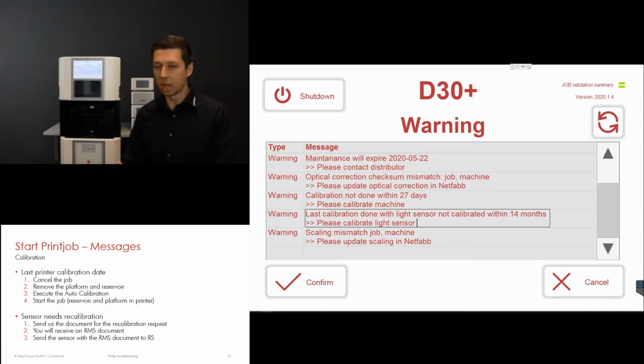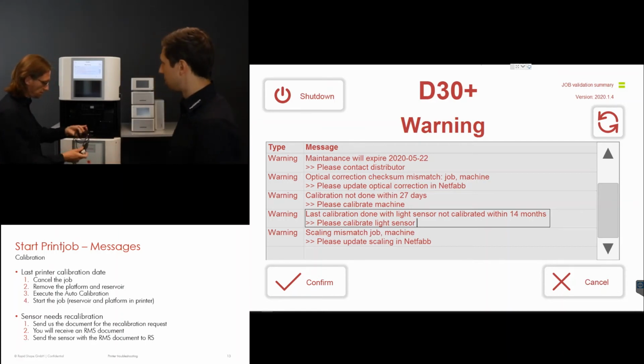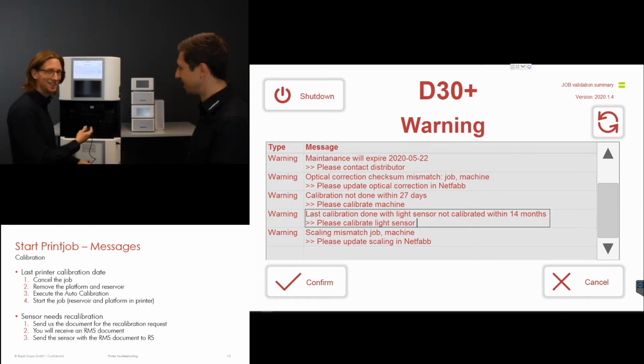So Robert is preparing the machine now, putting in the calibration tool, connecting the sensor, and then starting the calibration. Let me see, you're in the spot now. Yeah, thank you so much.